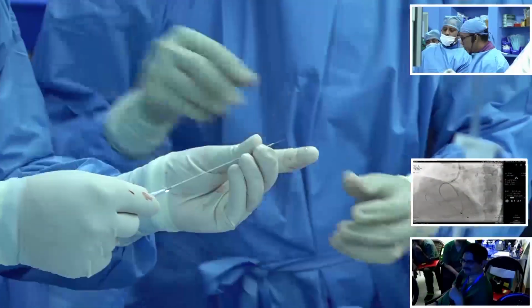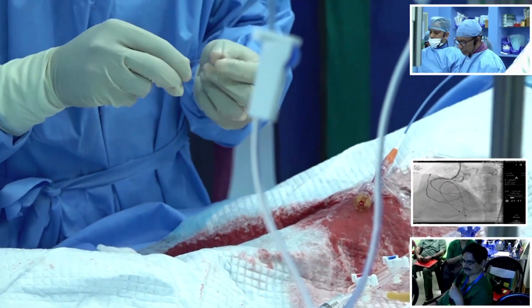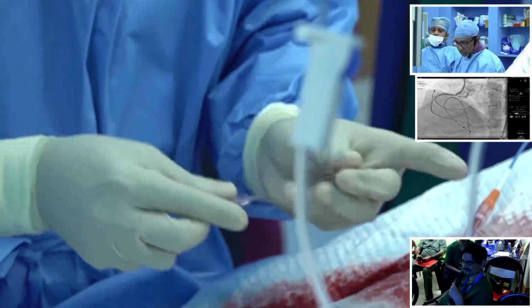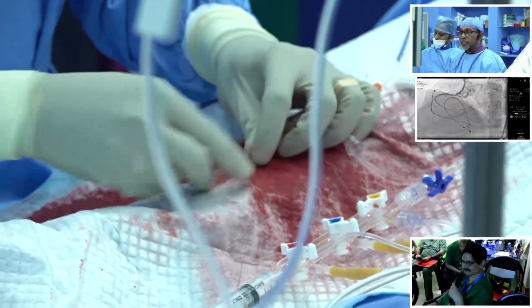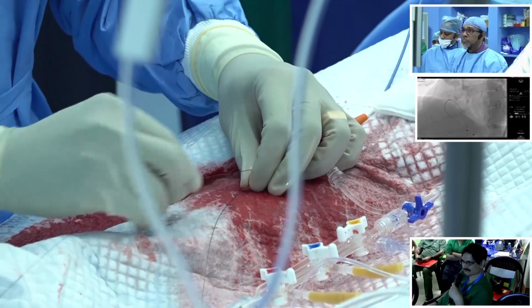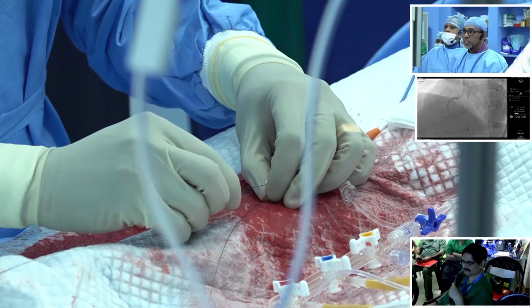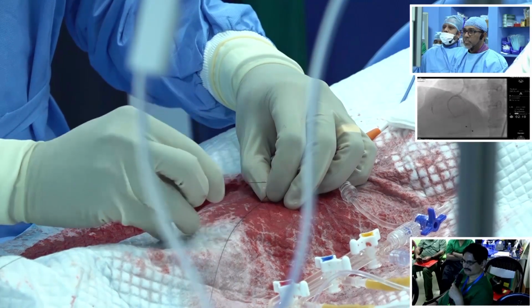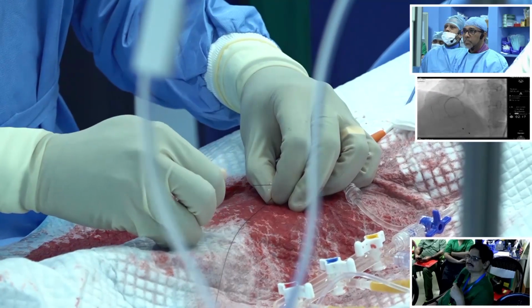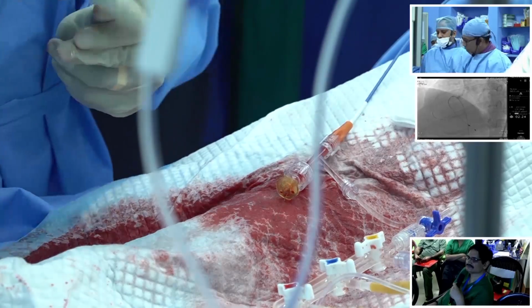After nitro, we'll do an imaging. Introducer.